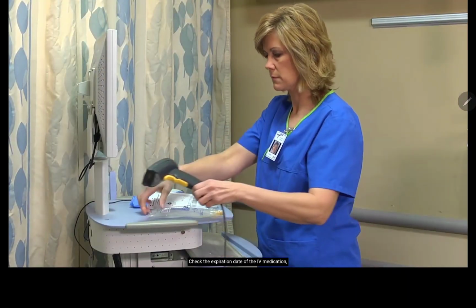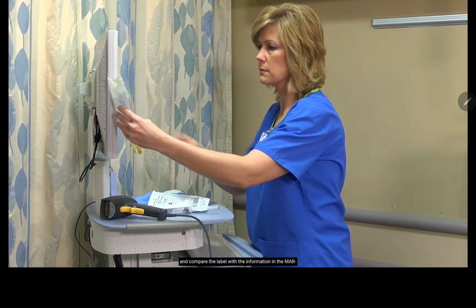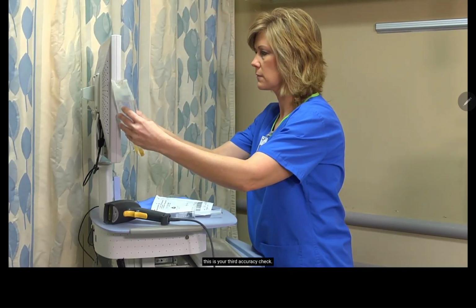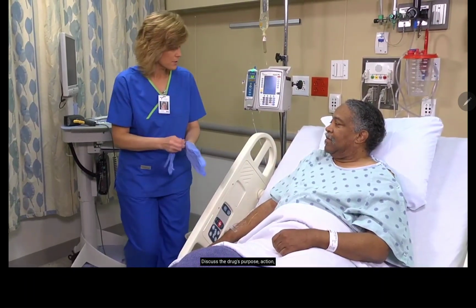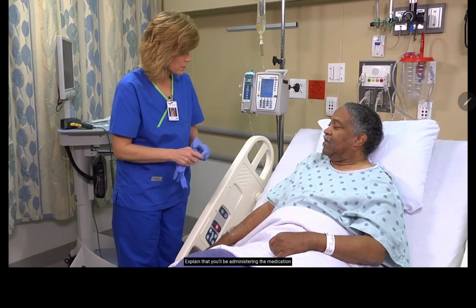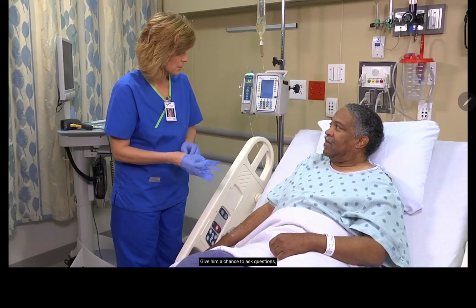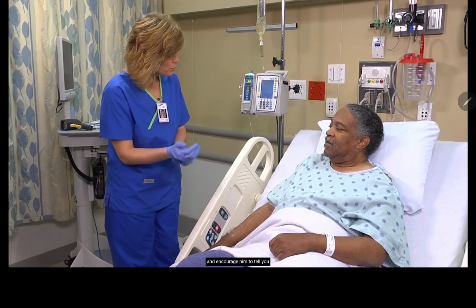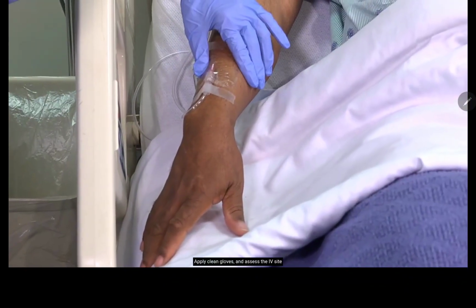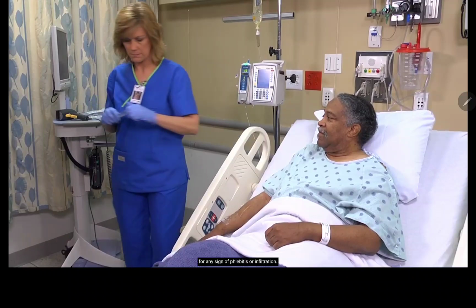Check the expiration date of the IV medication and compare the label with the information in the MAR. This is your 3rd accuracy check. Discuss the drug's purpose, action, and possible side effects. Explain that you'll be administering the medication through his existing IV line. Give him a chance to ask questions and encourage him to tell you if he feels any discomfort at the IV site. Apply clean gloves and assess the IV site for any sign of phlebitis or infiltration.